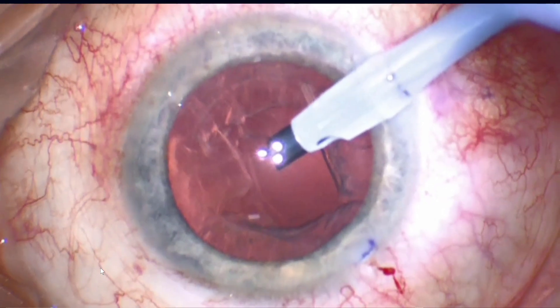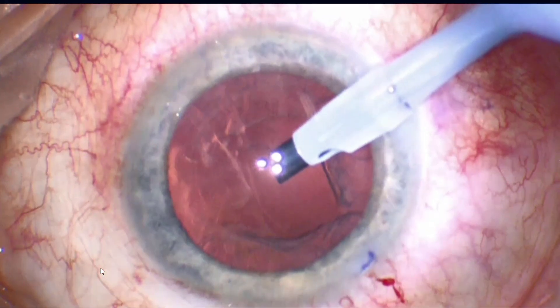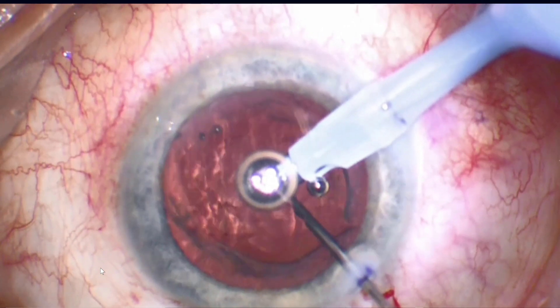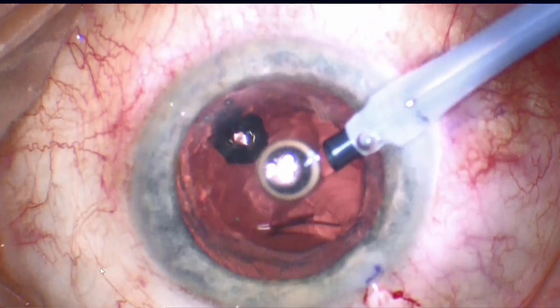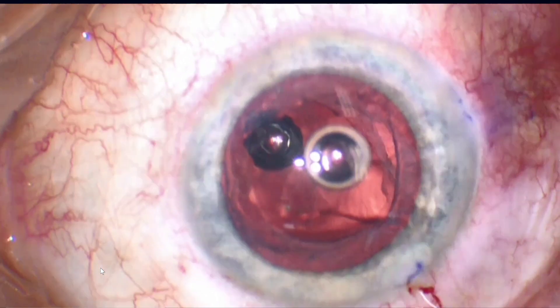I just want you to stop and ask yourself what should be our next step. This is something that's going to occur to all of us, and so at this point I think we really want to develop a reflex to move to the next step. I think the next step should be to add a dispersive viscoelastic. In this case we're using visco, which is nice because it's viscous, and that allows us to keep the chamber formed when we withdraw the phaco tip.